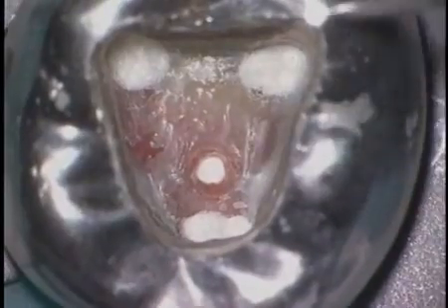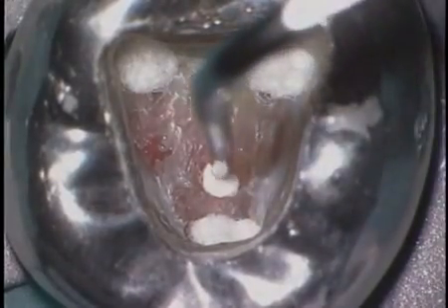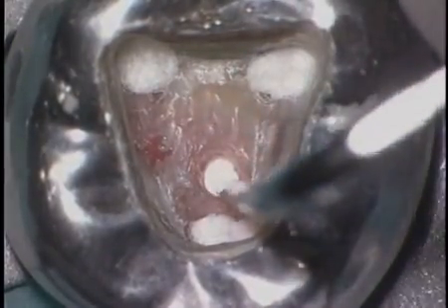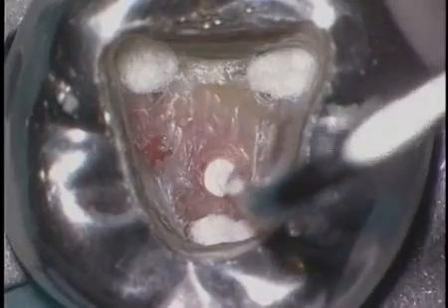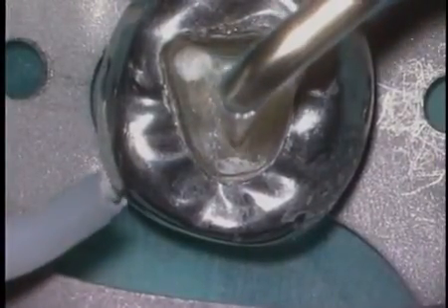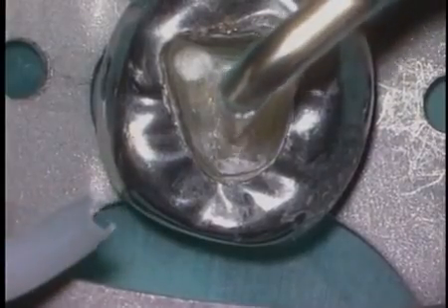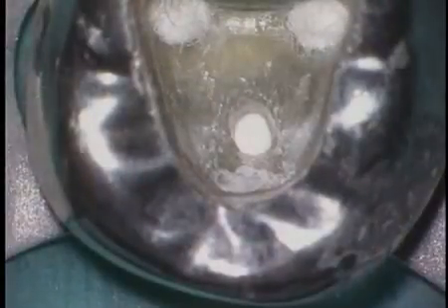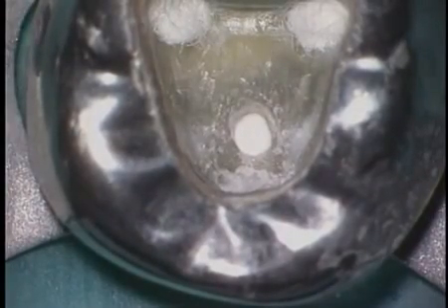If we put in too much Colocoat, we would be in tooth structure, and that material would be resorbed away in around 10 to 14 days. The last few pieces that are placed in can be packed with quite a bit of intentionality because we want a nice firm barrier to pack against. The preparation can be dressed out with ultrasonics, giving us unsurpassed vision and control, and then we can acid etch to provide a cleaner tooth surface if we feel this is appropriate.